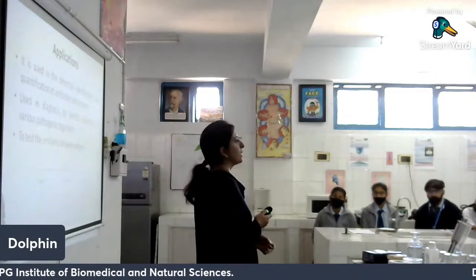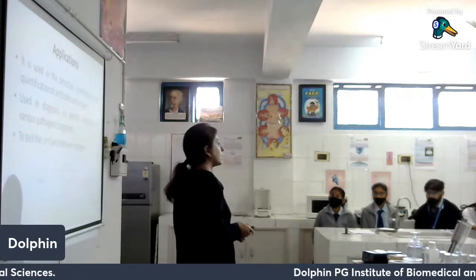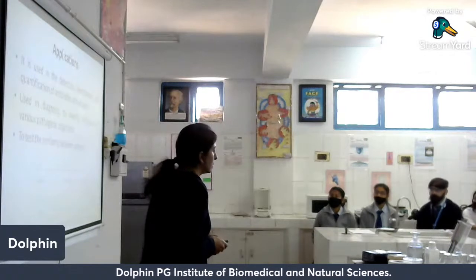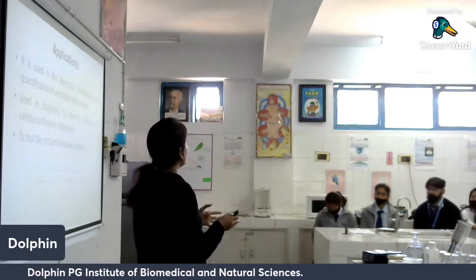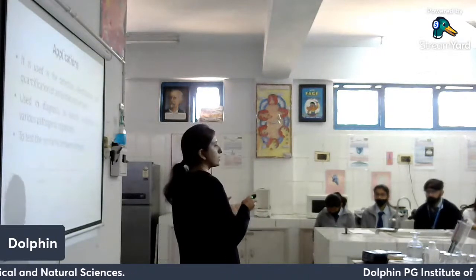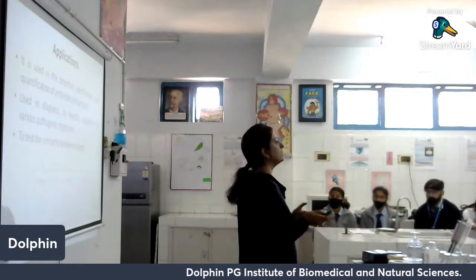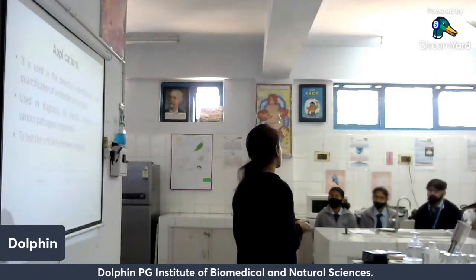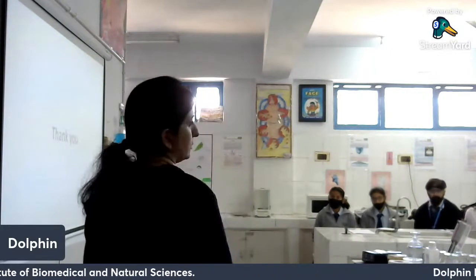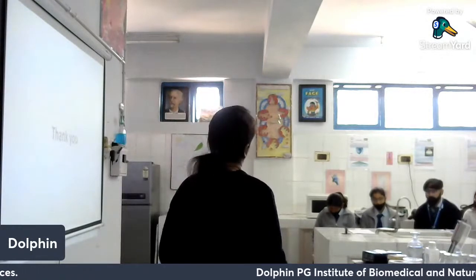In the case of Corynebacterium diphtheriae, there is a test known as the Elek test. That Elek test also uses Ouchterlony double diffusion to find out whether a particular strain is producing a toxin or not producing a toxin, by reacting the toxin with its antitoxin. That is also where we can use double immunodiffusion techniques. Clear? So these are the applications of the Ouchterlony double diffusion.